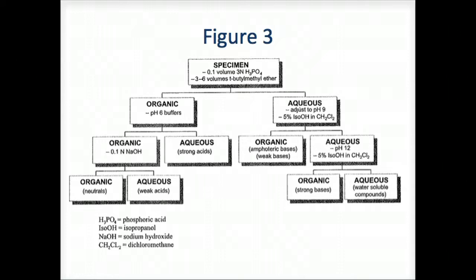The aqueous fractions are re-extracted into an organic solvent to obtain concentrated extracts that can be chromatographed. And you can see the sequence here of a specimen being in an organic aqueous phase, and again separation, organic aqueous on both sides.